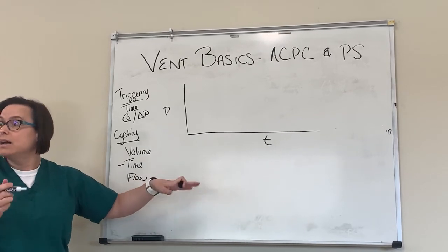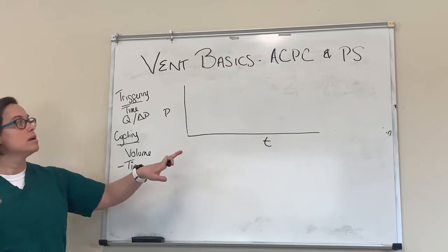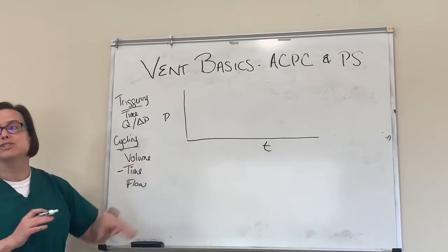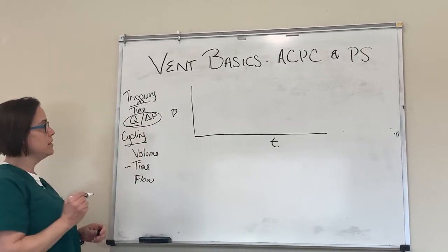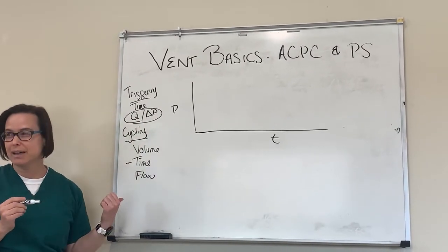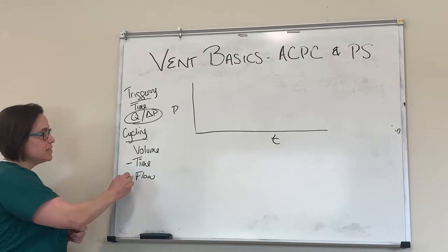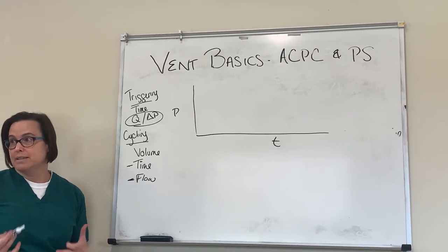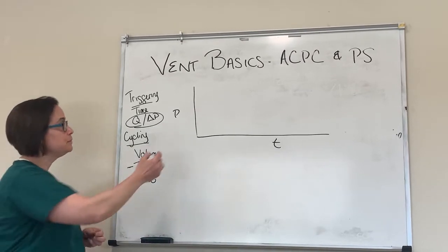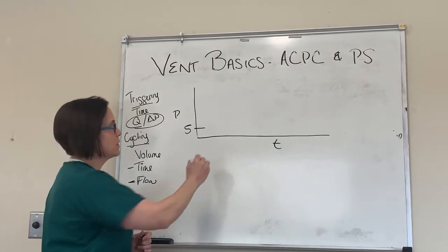The patient. Yeah, so now we don't really set a rate, except for a backup rate so people don't die, right? But we don't set a rate. We let the patient take all their own breaths, okay? So we're only getting triggered here, and then how do we cycle? How does the breath know to shut off? The patient actively. Yeah, so it's the patient flow rate that the machine understands and picks up on. So this looks a lot more smooth as it's going through.